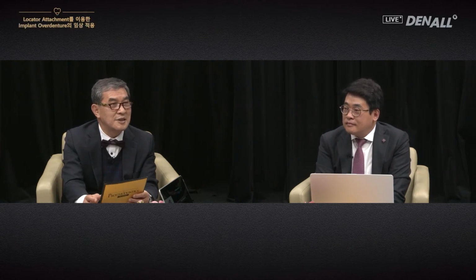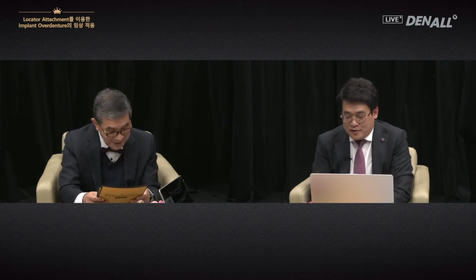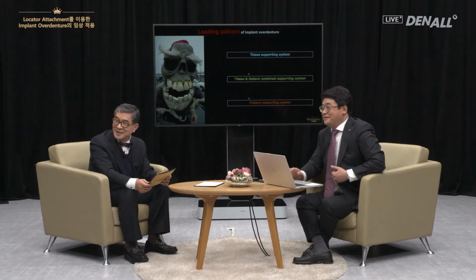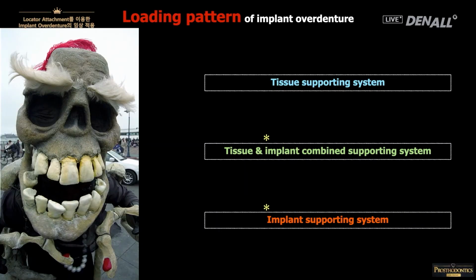The ISO, the International Organization for Standardization, recommends that the term fixture should be replaced in the future with implant. If you really want to emphasize the fixture, you should say implant body. And therefore, at Osstem, we decided not to use the term fixture. Okay, I will change. I've changed.